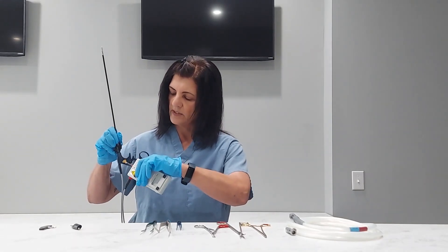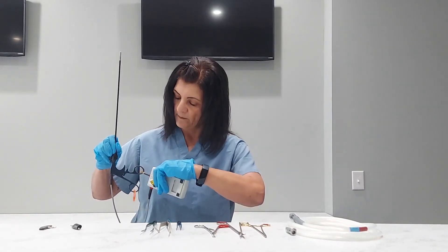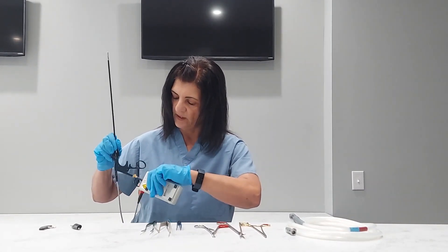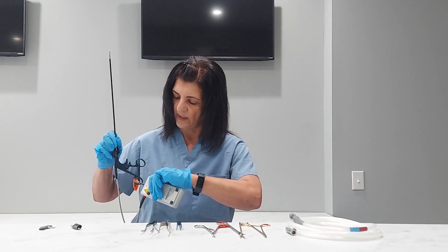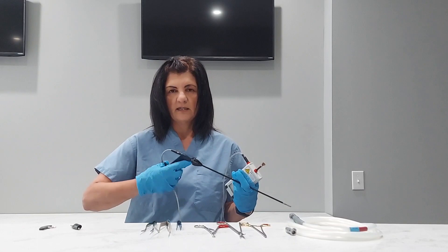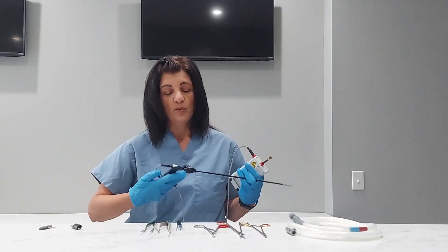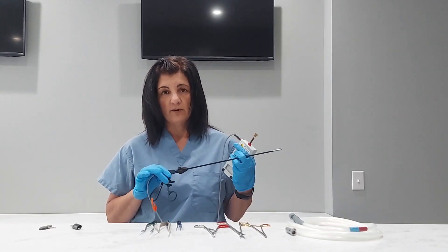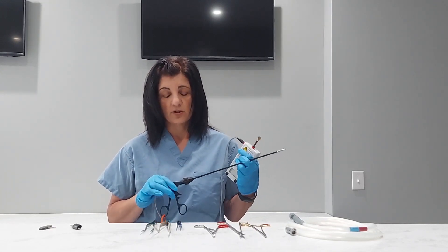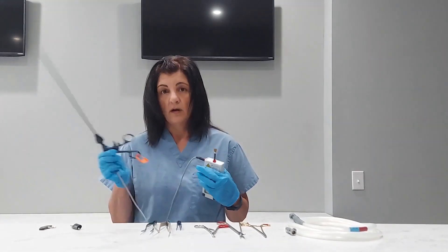Now you want to flip it over and do the same thing on the back side. Again, fails miserably. The thing I wanted to point out is when it's failing miserably especially around the handles — when they throw the current through in the OR and the doc has their fingers through this, they're going to get shocked. So it's very important if you have any metal handles on laparoscopic instruments, to make sure that you're testing those handles every time. So off to the repair room.